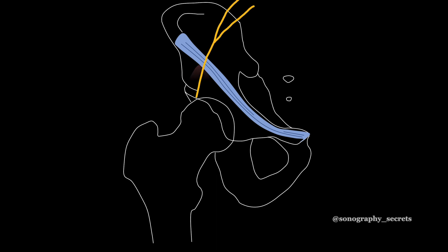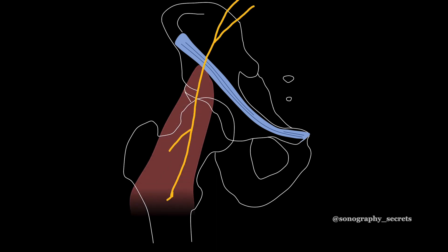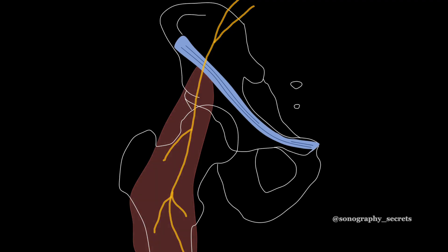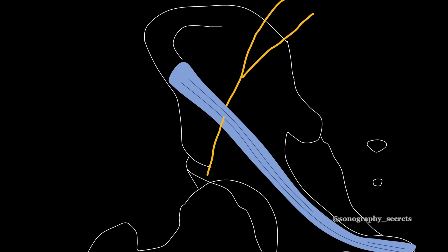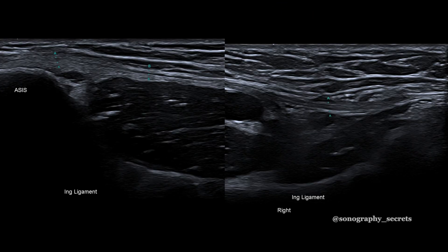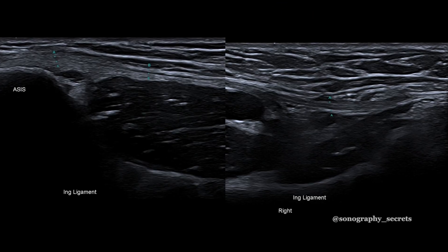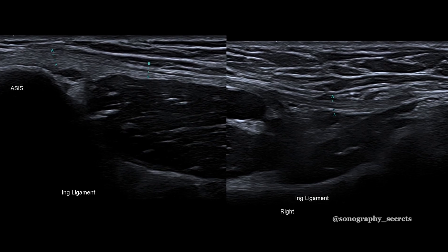The lateral femoral cutaneous nerve supplies the skin of the anterior lateral thigh. It can pass over, under, or through the inguinal ligament. To identify the nerve, I use the inguinal ligament as my landmark.